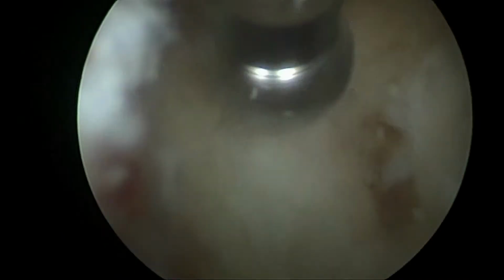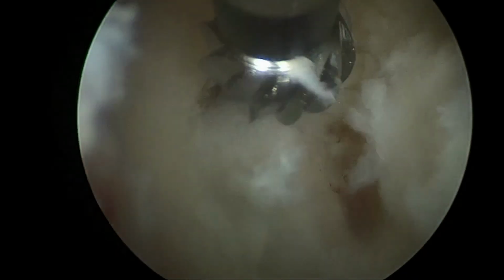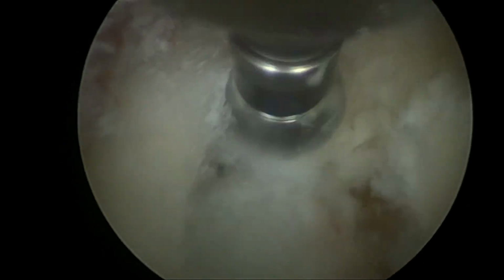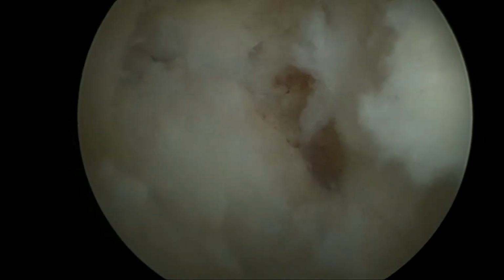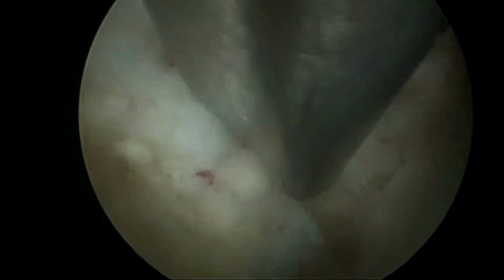My landmark for this is the very proximal tip of the ascending facet process, which you can kind of see right now behind the drill. This is an important landmark as it defines the area where the lateral recess is anatomically. And so by decompressing the entire medial portion of the ascending facet process, you are sure to adequately decompress the lateral recess.